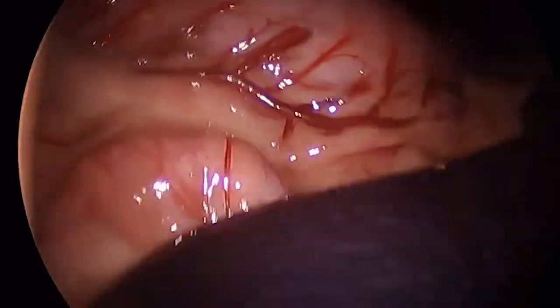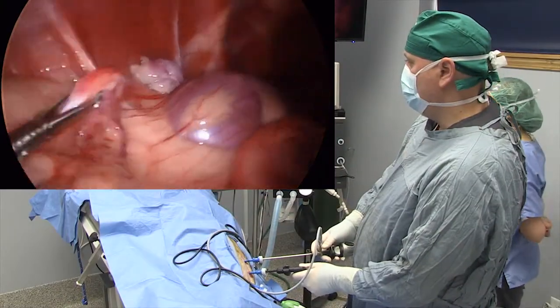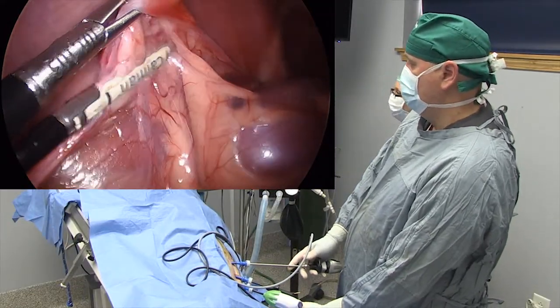When performing a laparoscopic spay, first identify the kidney, then grasp the ovary showing the suspensory ligament and uterine horn. The Caiman vessel sealer coagulates and cuts the tissue surrounding the ovary.